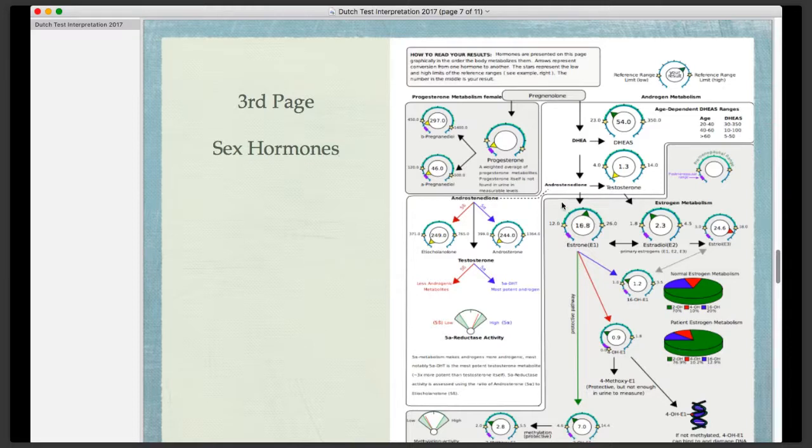And then the next section here is how estrogen is metabolized. And so this is, again, the main different estrogens that we replace. So estrone, estradiol, estriol are the main estrogens that we give in replacement. And this person is taking estriol, so it's a higher level here. But the star to star, again, is the cycling range, not the menopausal range. And then these are broken down into blue, red, and green metabolites. A normal woman's metabolism of estrogen looks like this. So there's green, red, and blue, and it's in a balanced state, right, in this sort of percentage.